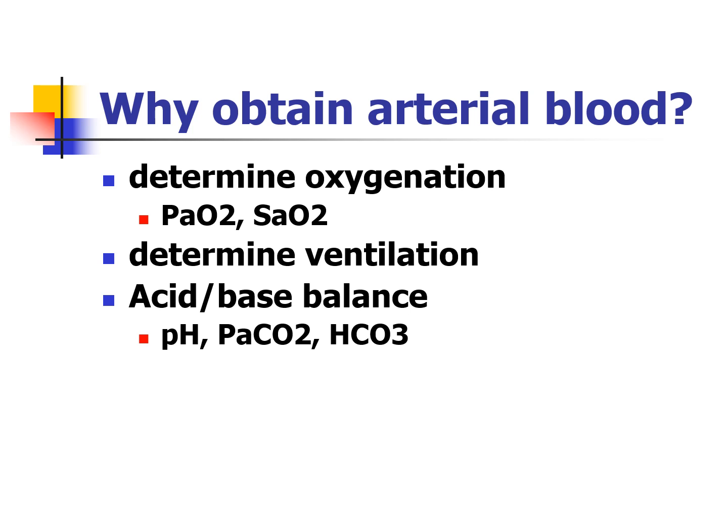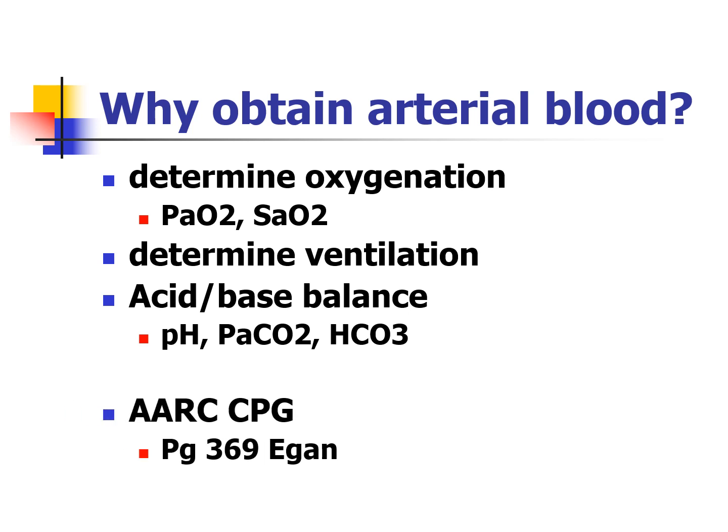Same thing with PO2. Usually try to keep that PO2 above 55, and the saturation, hopefully above 85 in a lot of survivability scenarios.